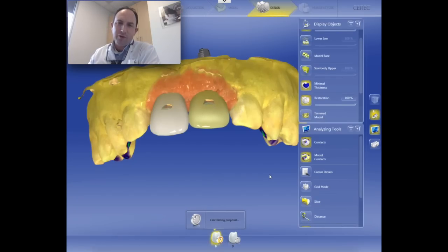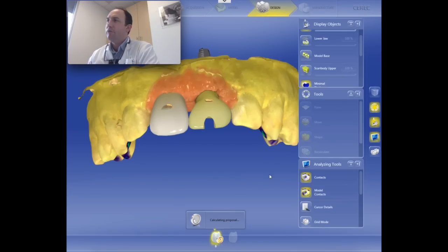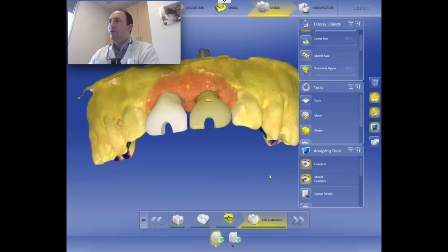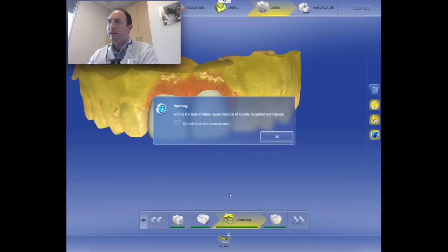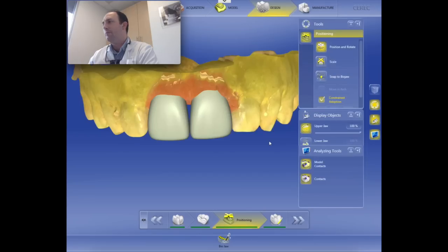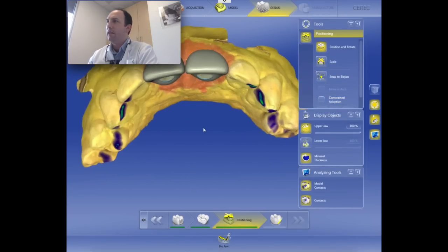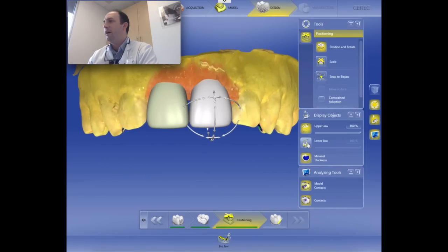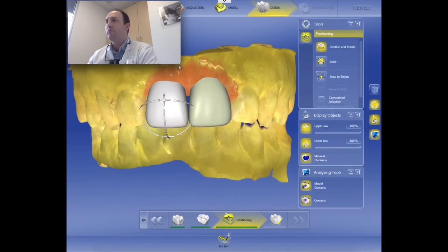And now it should give us a couple of proposals. Now my experience in previous versions of the software, 4.3, even all the way back to whenever it was we first saw dental implants, is oftentimes you get a really wonky, weird proposal. So it's helpful to know all the resources and tools that you have. So yeah, those don't look right to me. So a couple of things that we can do. I'm going to go to positioning. I'm going to change the position using the BioJaw feature. I'm going to hit OK. And I always turn this off. I hate that button. I want these teeth to be what I want them to be, not what the computer wants them to be for now. I'm going to turn back on the lower jaw. And you can see if we were to keep this positioning right now, this would generally work pretty darn well.